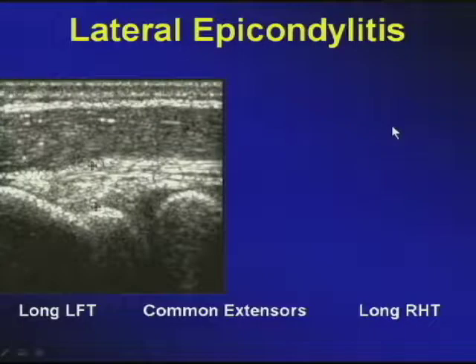When affected, you'll notice that it's very easy to look at left-right comparison of the elbow. You already recall that there is the intact fibrillar pattern of a normal tendon inserting onto the equally pristine radial epicondyle. Here's the joint space and the radial head. Around it is the multipennate structure of muscle.